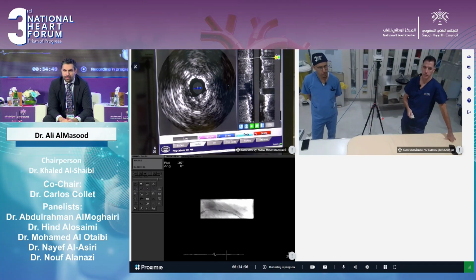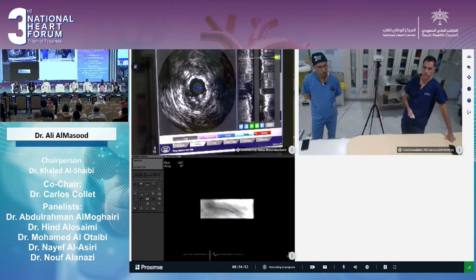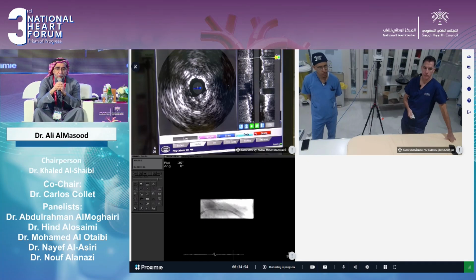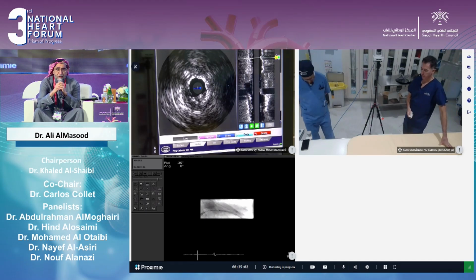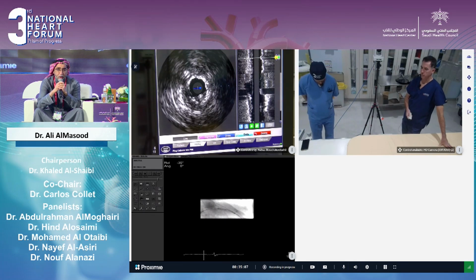A quick question. A lot of operators, at least in this part of the world, when the IVUS can't pass and you've got obvious calcification on fluoroscopy, frequently will reach for rotational or orbital atherectomy in a non-crossable lesion, because if the IVUS catheter doesn't pass, lithotripsy is not going to pass, and you know there's a lot of calcium there. So why did you choose an NC balloon rather than proceed with some form of atherectomy, especially since your imaging catheter did not pass initially?